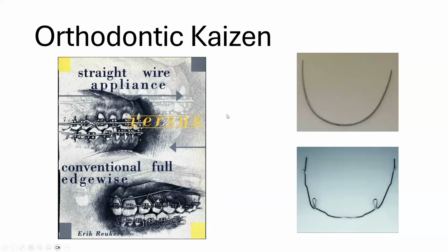And there's always controversy when these things come out. Right now, customized orthodontic appliances, that's the latest rage. We've been using customized aligner systems for 2 decades now, but there's a little bit of pushback about the customized bracket systems. And I found this online. I really liked it. This controversy has always existed. We have the straight wire appliance with Larry Andrews: pop a wire, put the bracket on, put a straight memory wire in there, have the patient come back, the teeth will all be straight. I'm sure that people were saying the sky was falling and that general dentists were going to take over the orthodontic industry, and all of these things, but none of it came to fruition. But we graduated on from the Edgewise appliance.